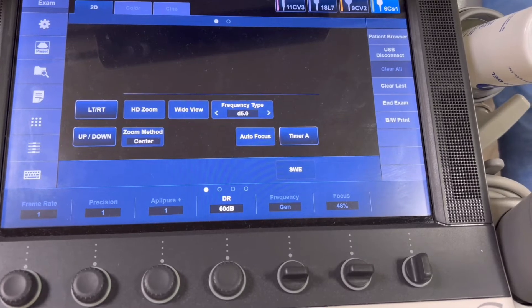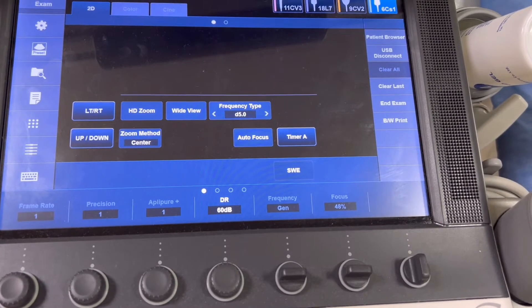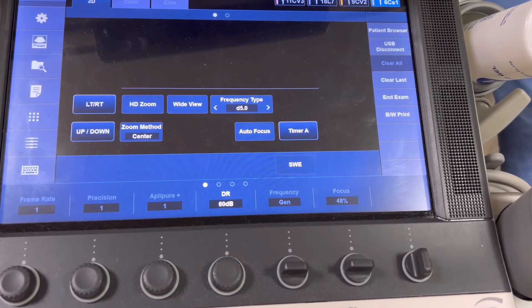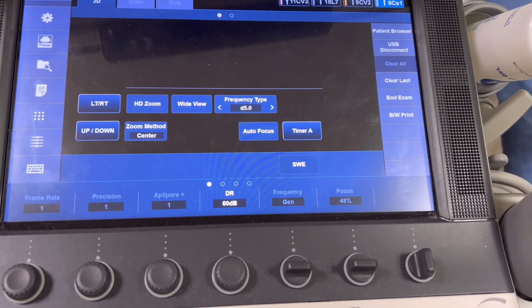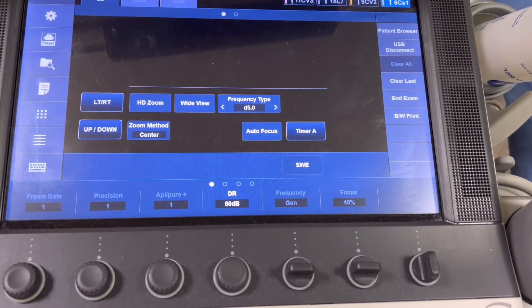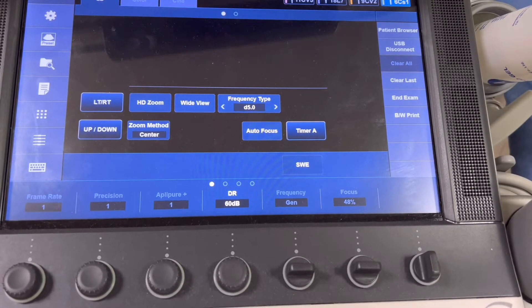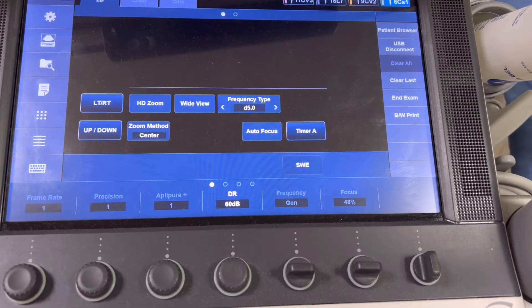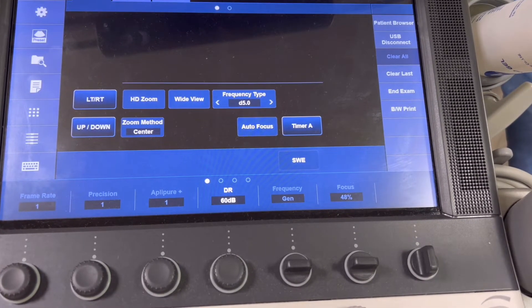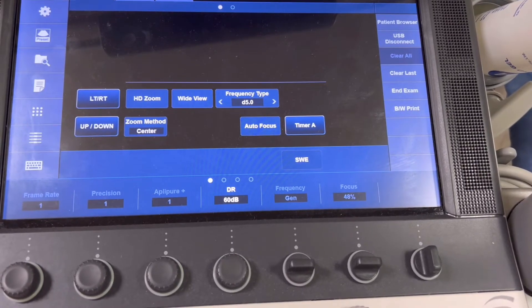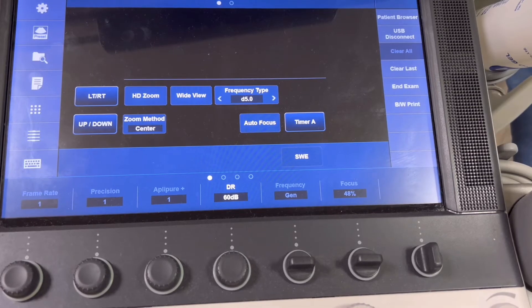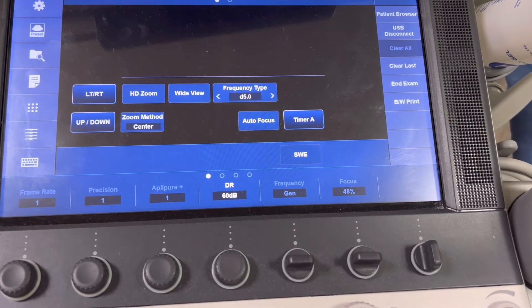The majority of machines nowadays have touch screens where you can also find other controls and details about the ultrasound modality that are essential for obtaining high quality images for diagnostic purposes. This includes the selection of probe or transducer, the frame rate, adjustment of precision, the decibels, and as well as the focus adjustment.